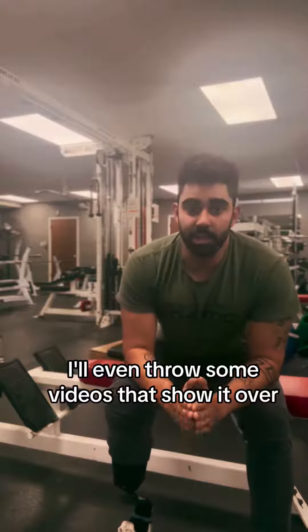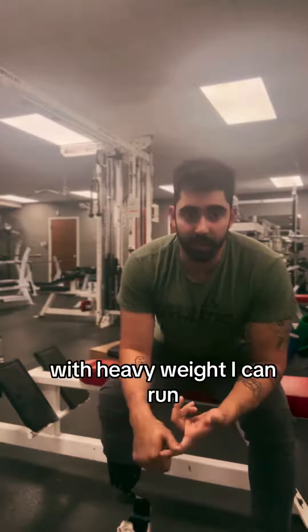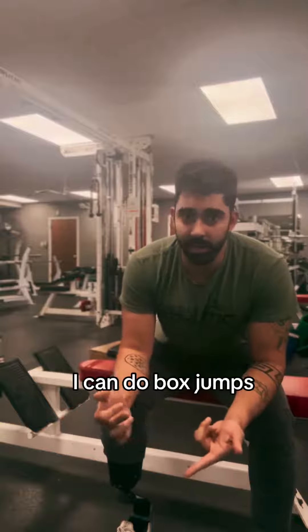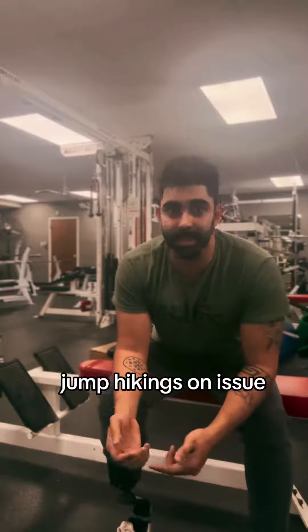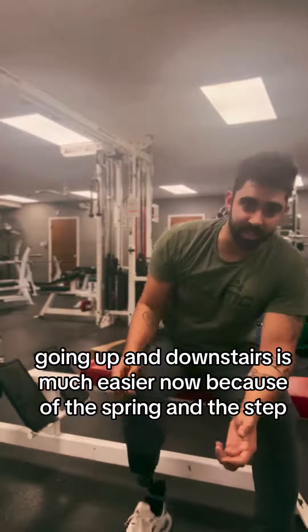I'll throw some videos that show it. I can do squats, deadlifts with heavy weight. I can run, I can do box jumps, jump — hiking is no issue. Going up and down stairs is much easier now because of the spring and the step.